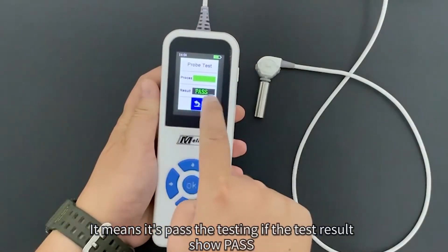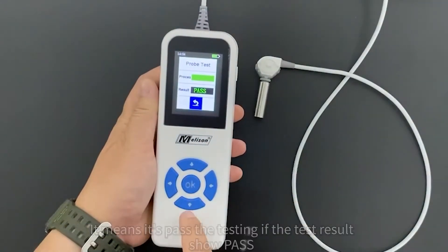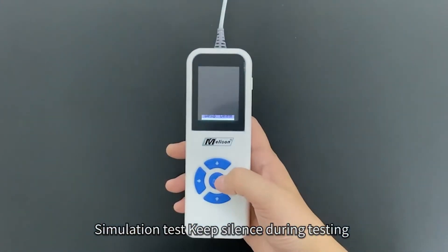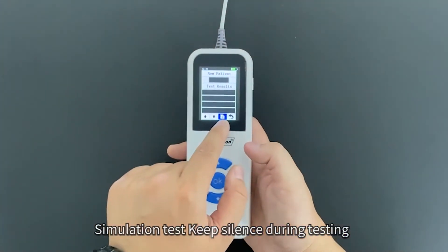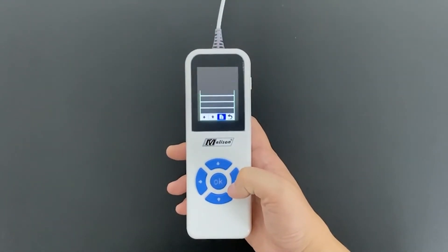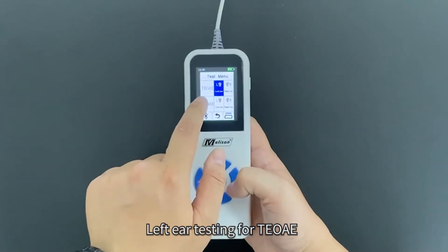Test probe: if the test result shows pass, it means it has passed the testing. Then run the simulation test — keep silence during testing. Left ear testing for TEOAE begins.